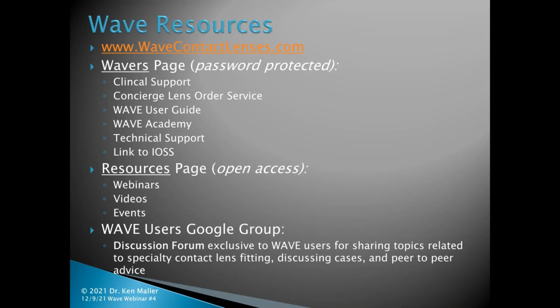So my general rule of thumb is the only people I do not average astigmatism for are ortho K cases. For every lens that's going to be worn for daytime use, through normal open eye wearing, I will for the most part always average the astigmatism, because you get a much easier handle on what's going on in terms of your design.